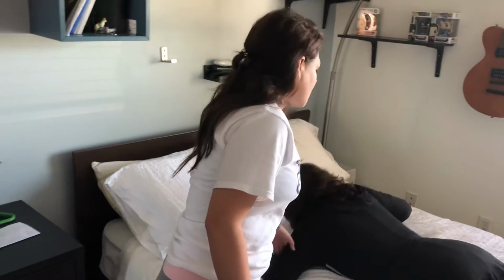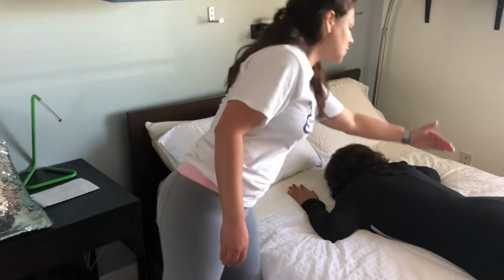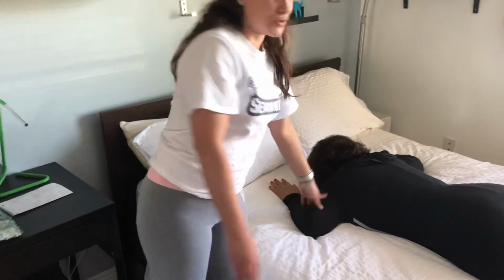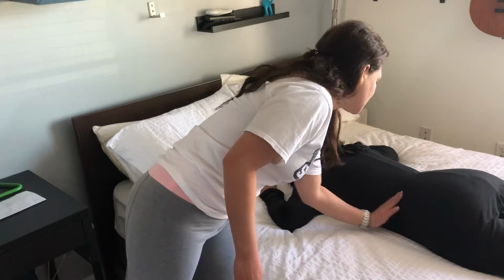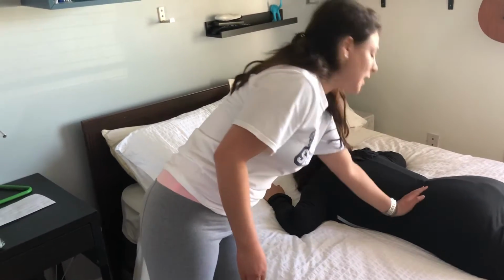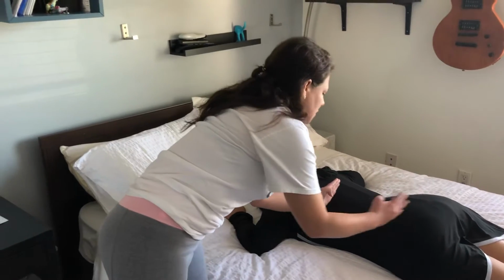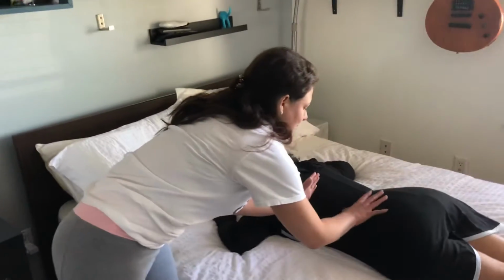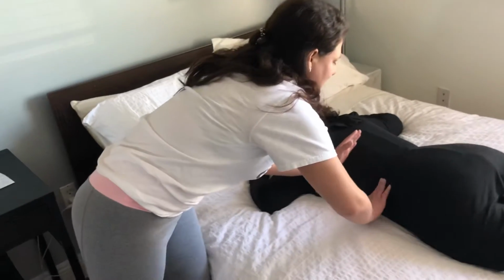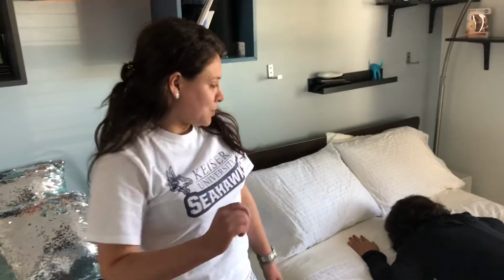We're gonna do the PA examination to see that there are no abdominal contents, the bowels are clean, and nothing can obscure the anatomy. So I'm gonna ask her to lay on the bed in PA position. I have to make sure that she is aligned on my sagittal plane, completely straight. The center ray is gonna be at the level of the iliac crest. I'm gonna use a 14 by 17 cassette, which will be from here to here. Okay, so that will be the first position.